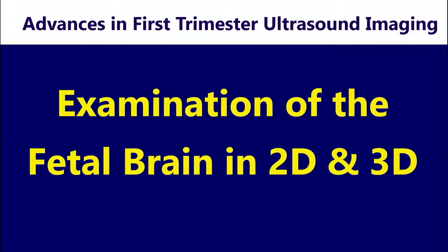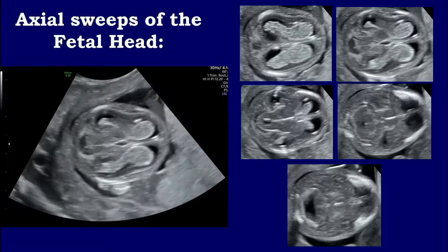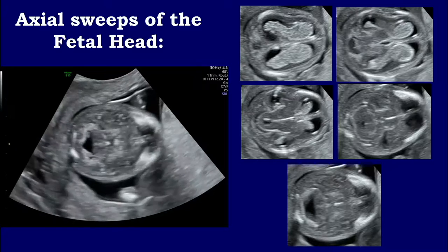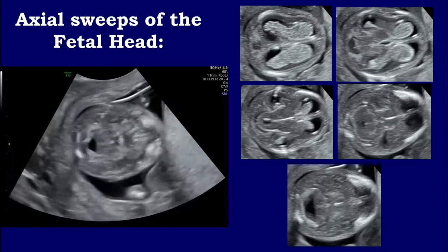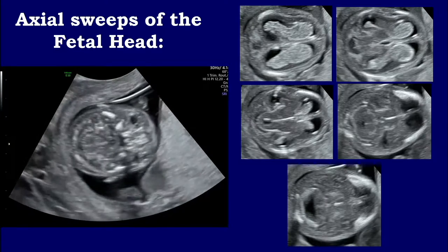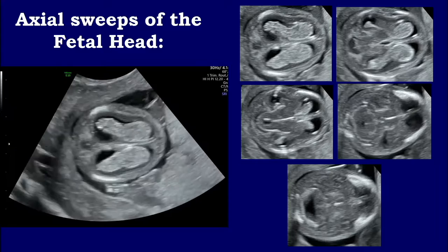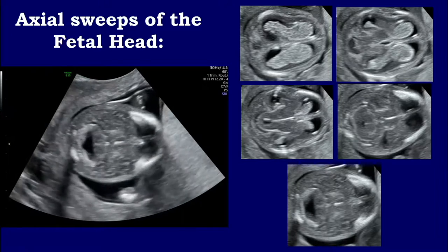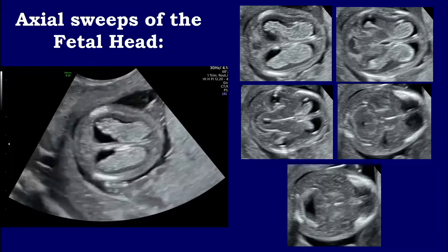I will demonstrate how useful it could be. First, let's go back to our traditional 2D imaging. We can take the sweeps or still images in one plane. Here you can see the axial sweep of the fetal head at about 13 weeks of pregnancy, and you can see that multiple views can be obtained from that sweep, containing a lot of information.